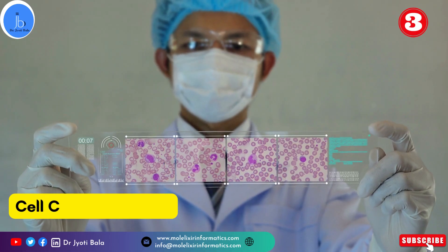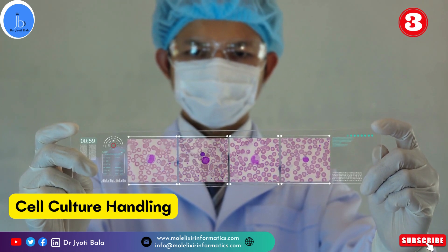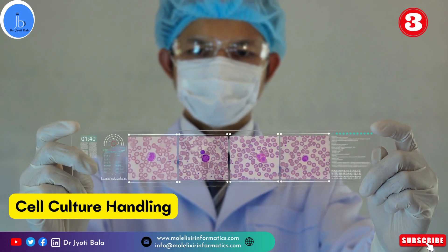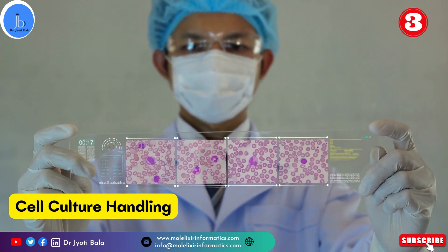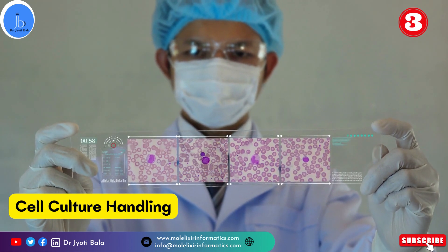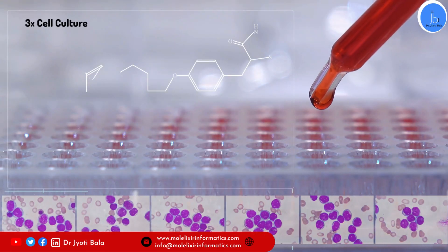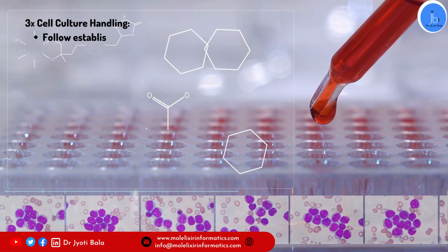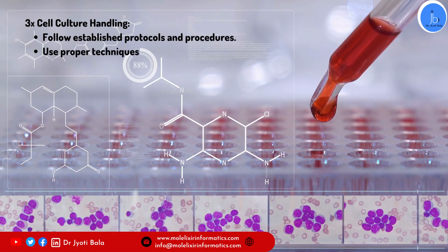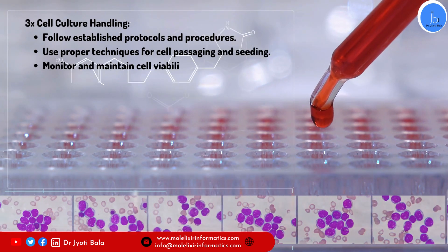Additionally, proper cell culture handling is important. When it comes to handling cells, it is crucial to follow established protocols and procedures. I myself have experience working on cancer research, so I have quite frequently used multiple cancer cell lines. It is important to follow proper technique for cell passaging and seeding to maintain cell viability and growth. Remember to monitor your cells regularly and to prevent cross-contamination, always handle different cell lines separately and clean equipment between users.